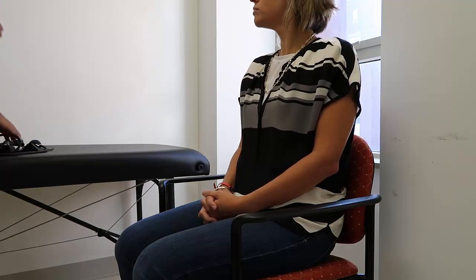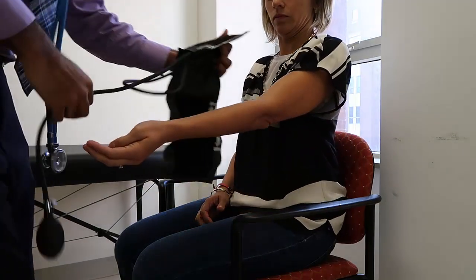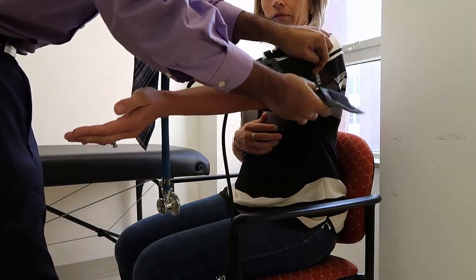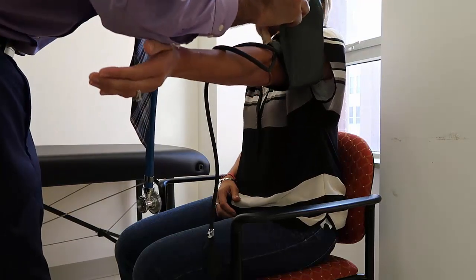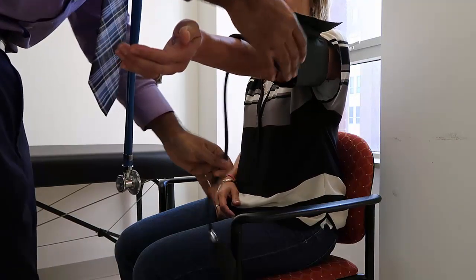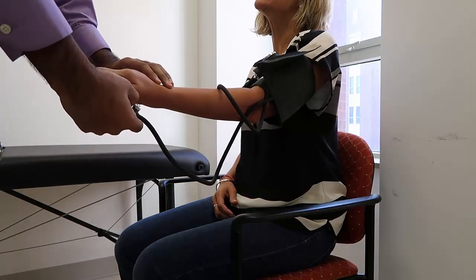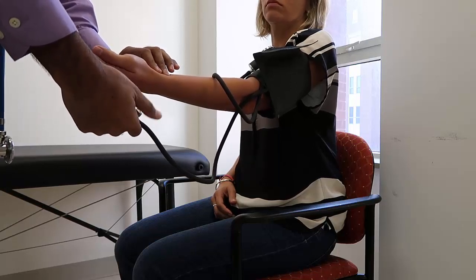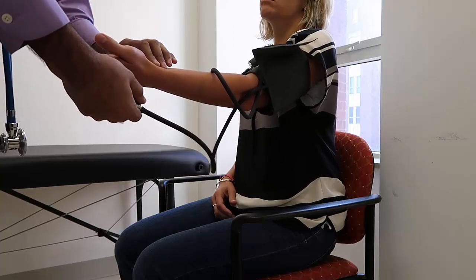I'm going to put the blood pressure cuff on to make sure it's the right size for you, and then I'll ask you to lift your arm to have it parallel to your heart so it will be level. Do you have a preference which arm I use? Okay. Have you had your blood pressure taken before? I have. So this is probably something normal for you. It looks like it's within range — I'll make sure this is on snugly. Is that too tight for you? Feels good. I think that's a good fit. Before I get started, I'm going to check your pulse to help me determine where to inflate for the blood pressure reading.